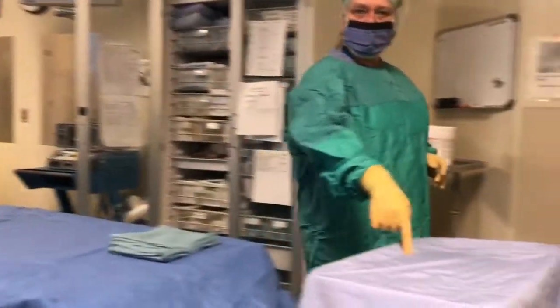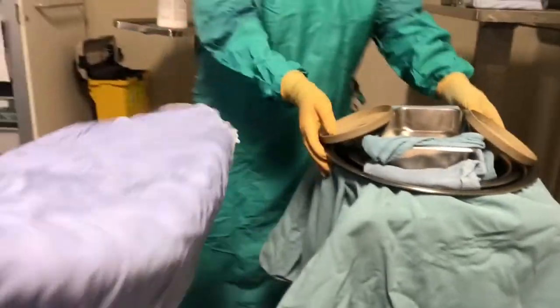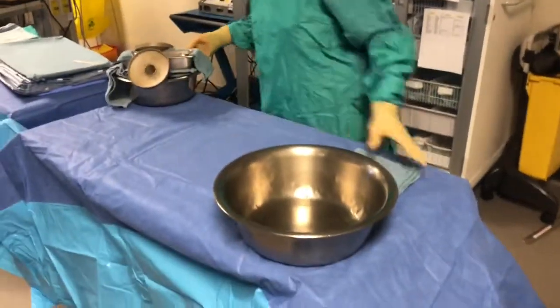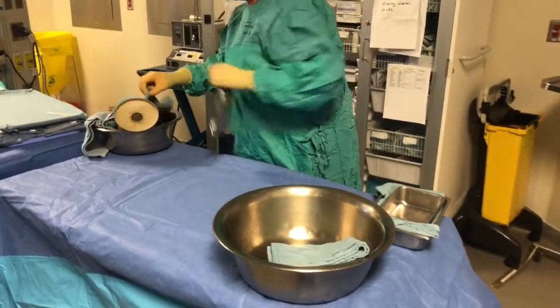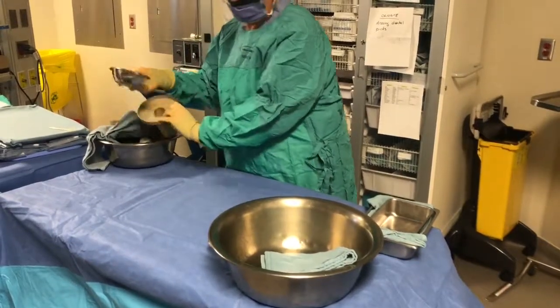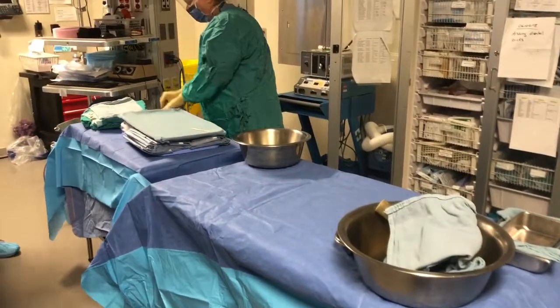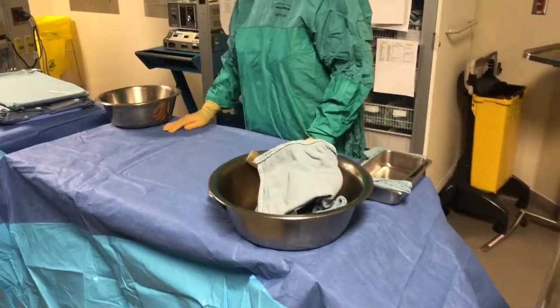And then my circulator would take this for me because I have to drape it. So if you could grab that, just pull it off. All right. So this is going to go here. It's going to go here. I'm going to put this here. Here for my circulator. Okay? Now you've still got your whole table all open, right?